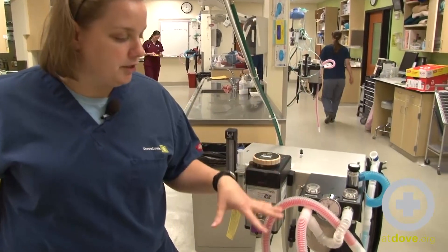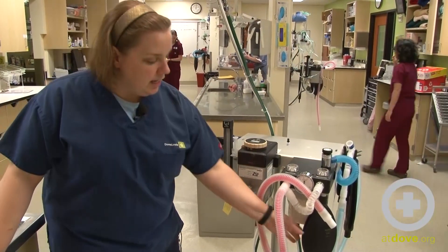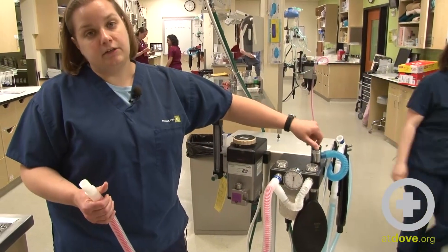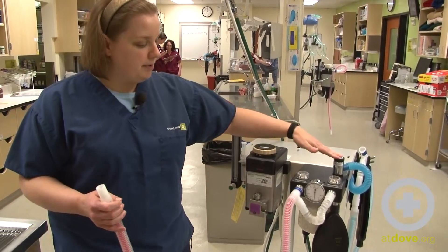So what you want to do first is get all of your equipment hooked up. For this patient, I have a pediatric anesthetic circuit and then a 2-liter reservoir bag. You're going to start by closing your pop-off valve. Your anesthesia machine may look a little bit different than this, but it's going to have all of the same parts to it. So close your pop-off valve.